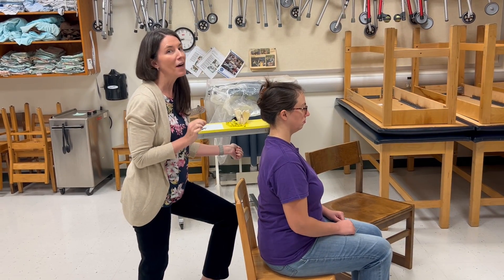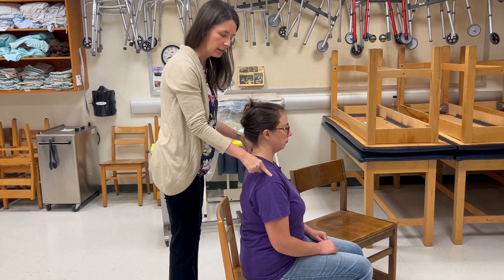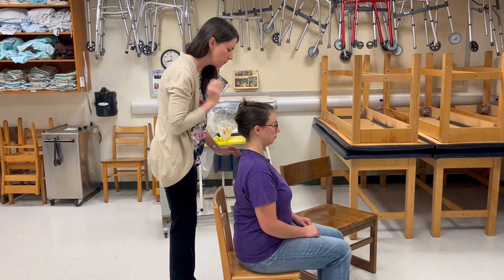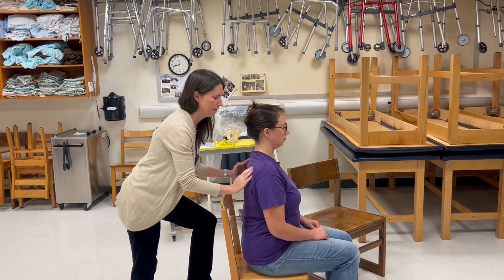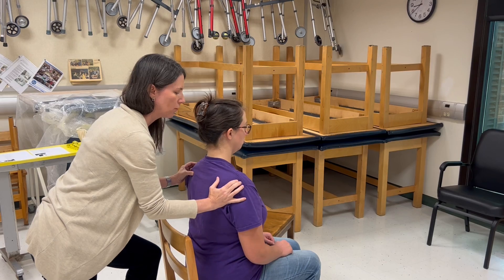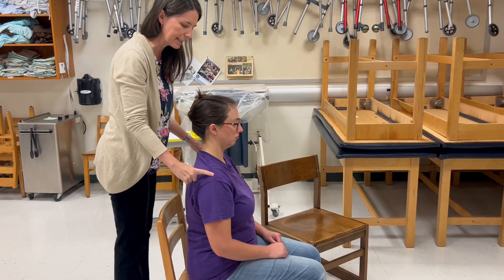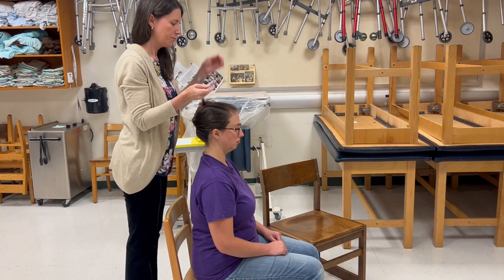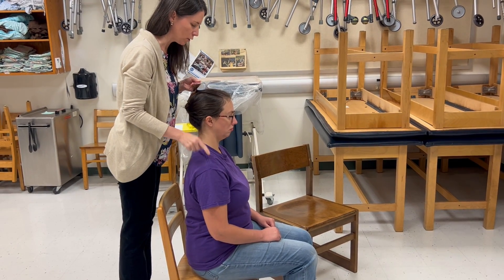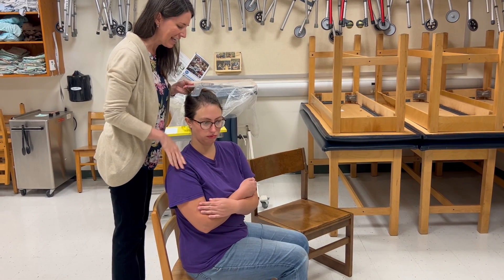We are going to assume that the line connecting the two acromion processes when the patient is in neutral is parallel to the line connecting the two iliac crests. I'm going to palpate the spine of the scapula bilaterally, take it out laterally, round that little corner, and now I'm on the lateral edge of the acromion processes. I have to line up my stationary arm parallel to that line connecting the two acromion processes.